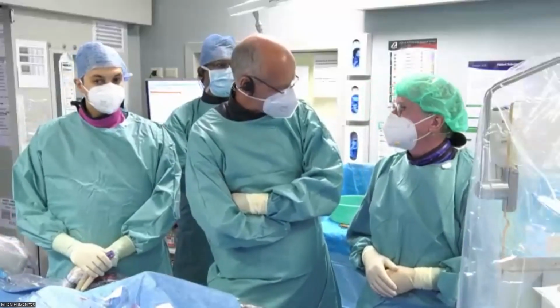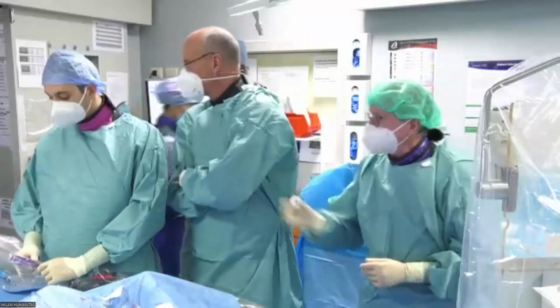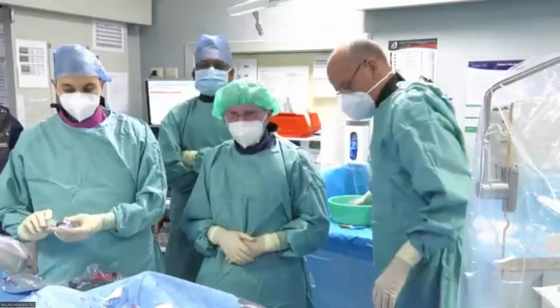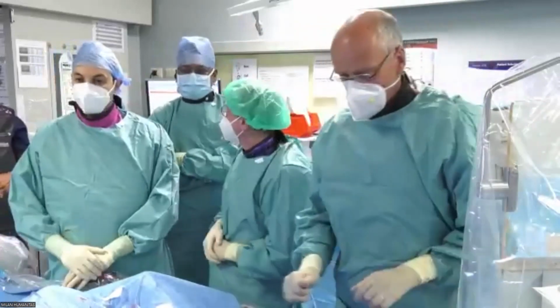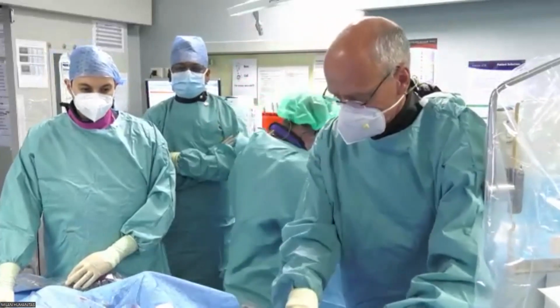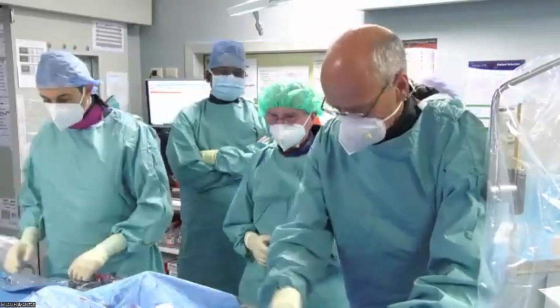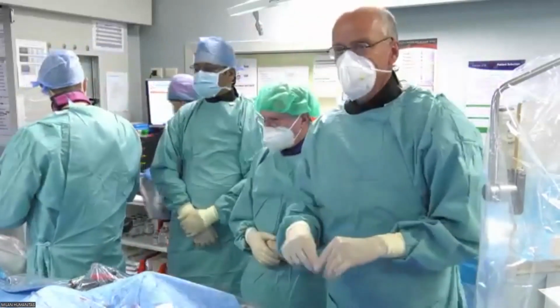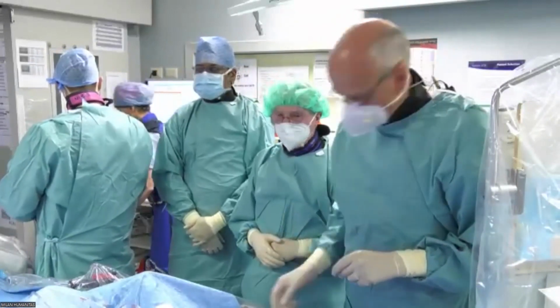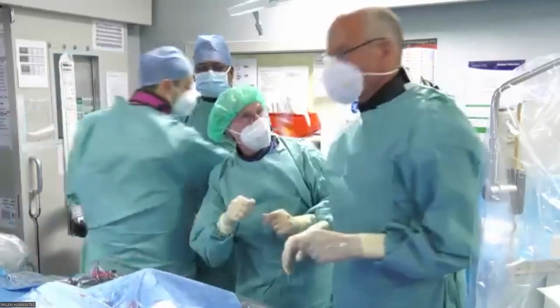3.5, 15, and postdilate. Yes. And I think Bernard should do that. So the question was, does imaging make a difference? I think that what imaging helped with is the size of the vessel. I do think it will help for optimizing the stent if it was placed proximally. But distally, the one thing you need to know about imaging is when to use it, when not to use it, and how to use it. If you did too much imaging and ended up placing a stent across the diagonal down to the apex, that would be an overuse of imaging. So you have to be really good at doing it, and know when to use it and when not to.